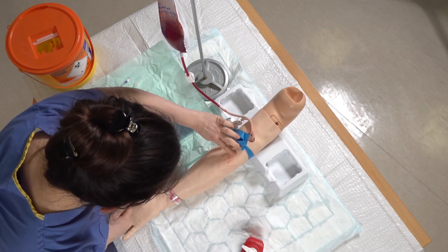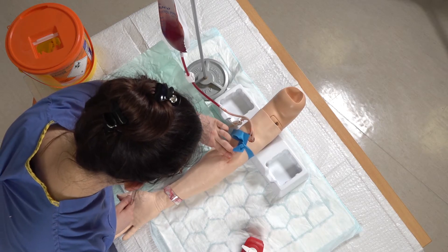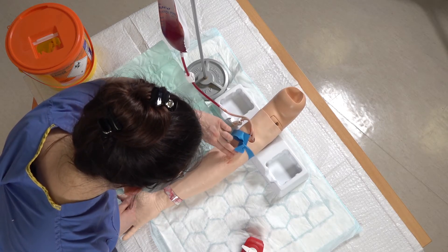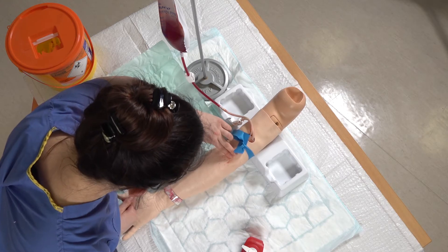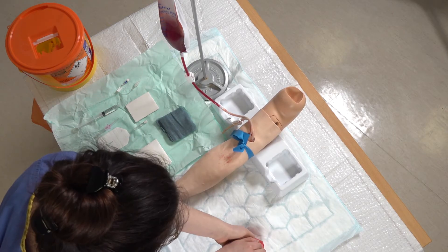Next I'm just going to palpate for a vein along the area. I'm happy with that vein, so I've moved on to prepare my kit. I wash my hands again.